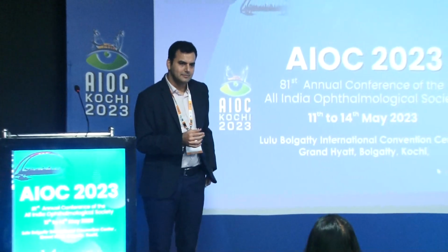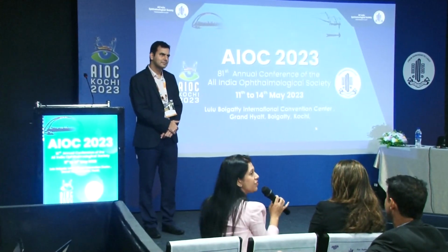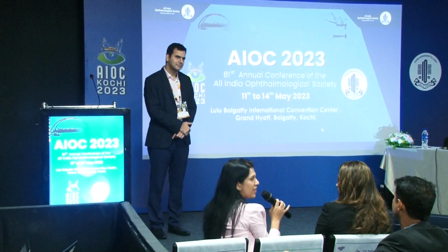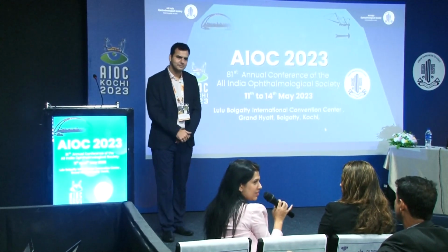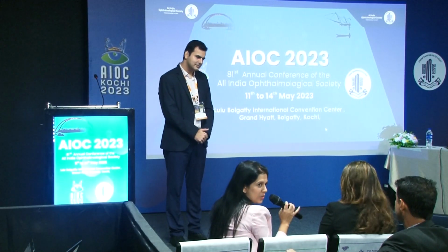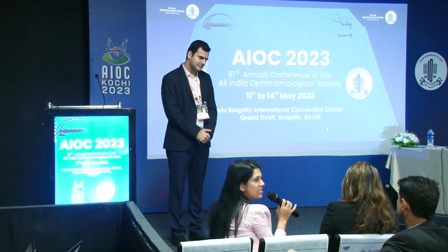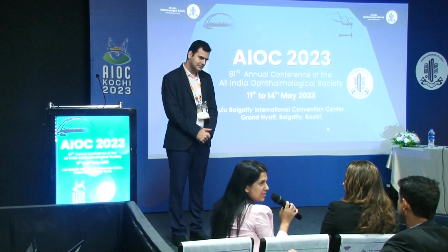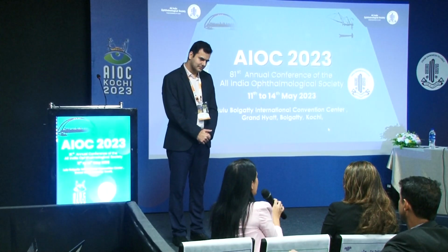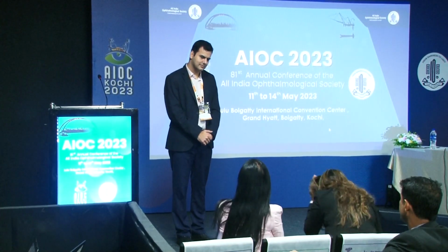So you're saying the cataract developed post ICL, like an anterior subcapsular cataract. I've seen about three patients, out of which the first two had very faint anterior subcapsular cataracts that were not visually significant. They're not the kinds that progress rapidly. They're not age-related nuclear cataracts or posterior subcapsular cataracts. So if they're very early, I would still observe, follow up, and see if they're causing symptoms to the patient. If at all surgery is required, I've had one patient where it progressed quite rapidly.